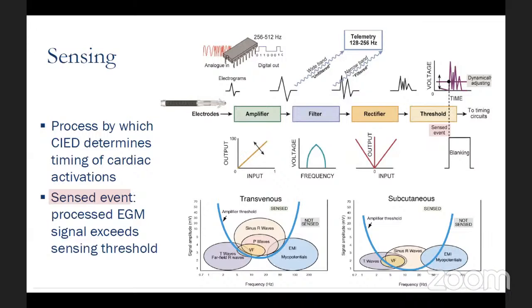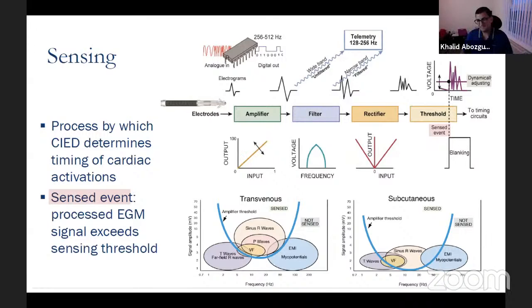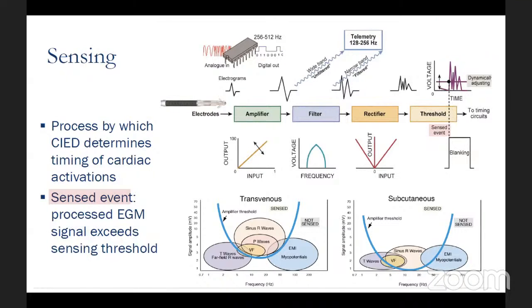And to add on, if you have an MRI compatible lead from Medtronic, and an MRI compatible device from Biotronik, and for some reason you use a different lead for that, the manufacturers say no MRI. So for liability, the radiologists are liable. Unfortunately, they don't allow patients to go to the magnet until we have more evidence or guidelines to support the use of that. Although this is very reassuring information, and it's really good to hear.